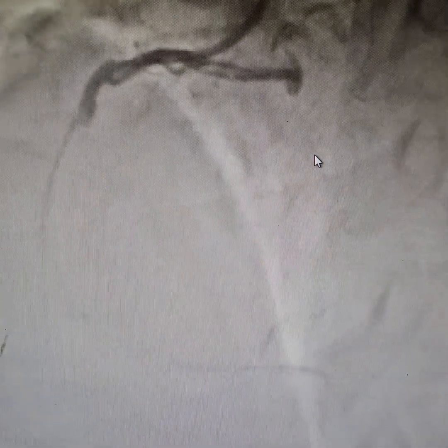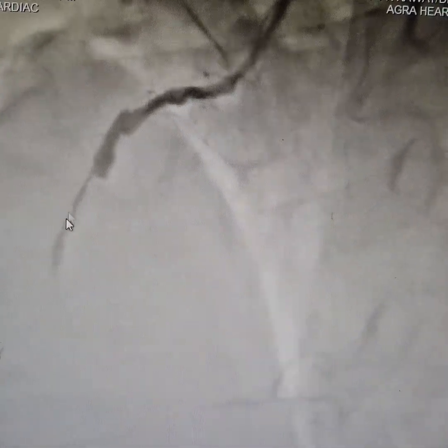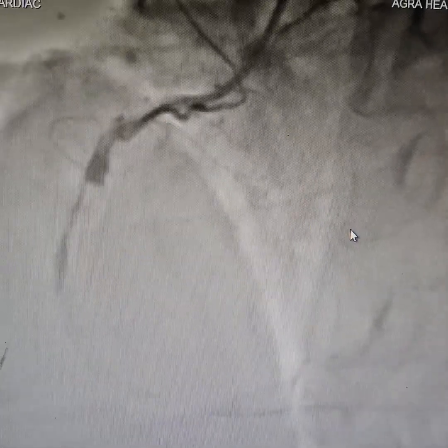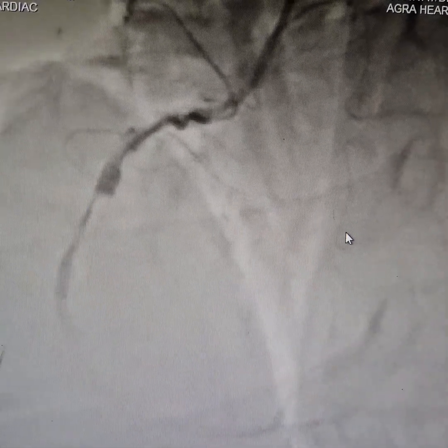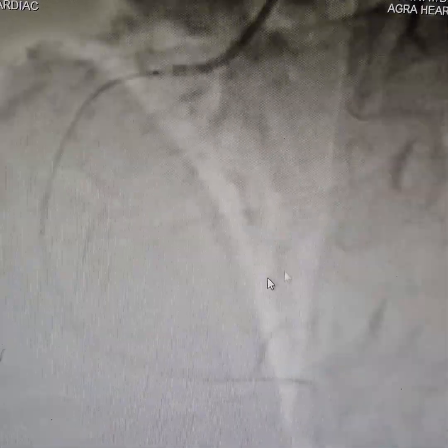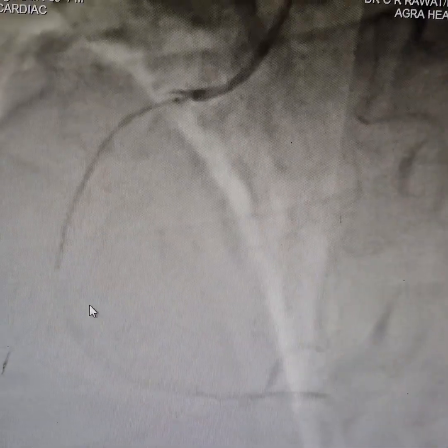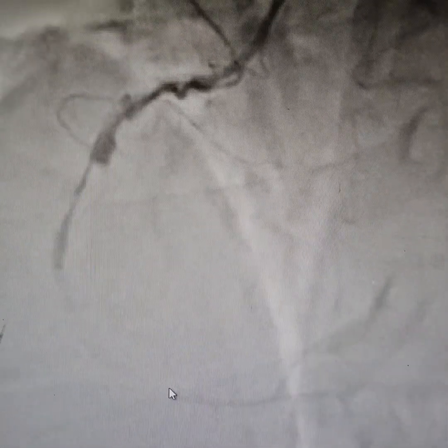Always remember that you should only put a stent when you can visualize that there is flow. If you put a stent in TIMI zero flow, you are going to get TIMI zero flow. The flow that you generally get at the start, or just before you put a stent, is the flow that you might get after stenting. So we have restored the flow and now we are checking where to put the stent.